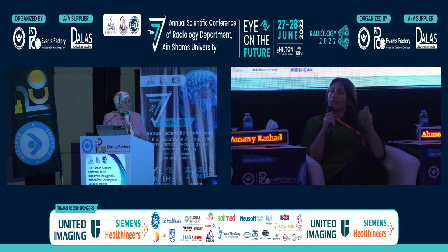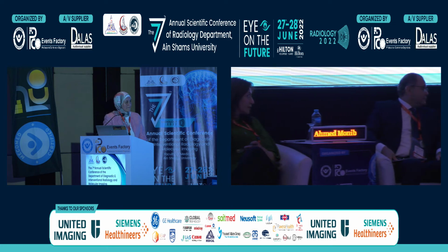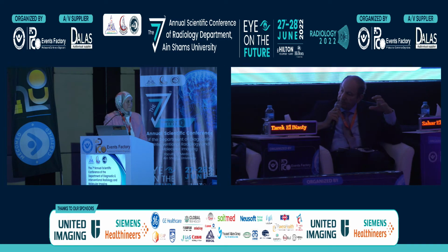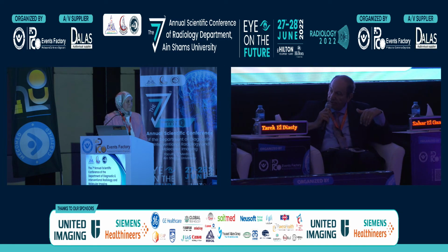So you would prefer CT for nodal staging, it is better, and for abdominal staging, but not for discrimination between muscle invasive and non-muscle invasive bladder cancer. It is for nodal and extravesical staging. Yes. But I have a comment: nowadays, it's proved that MRI is far superior to CT in staging of bladder tumor, so CT shouldn't be requested for the T staging of bladder tumors. Yes, maybe if there is an advanced tumor and we look for distant metastasis, we may do CT, but for tumor staging, it's only MRI. They should start with MRI, and when they need to look for very distant metastasis, then they do the CT.